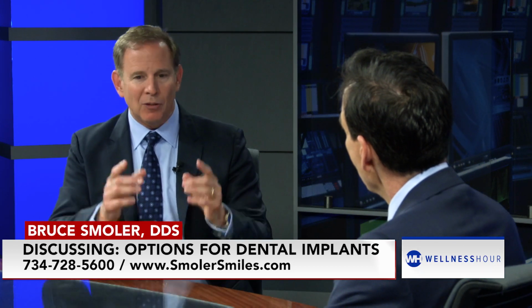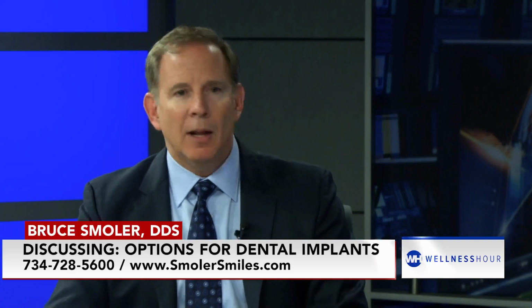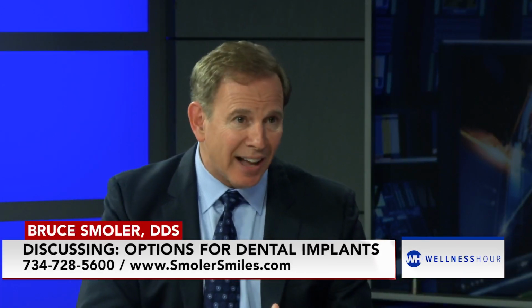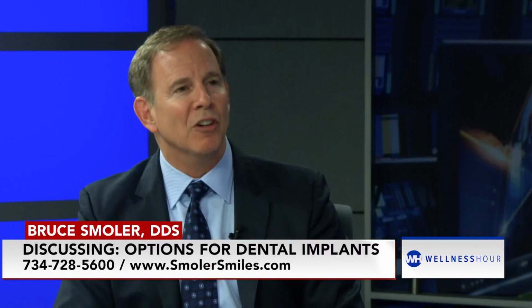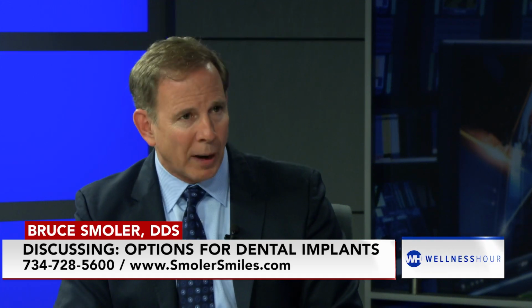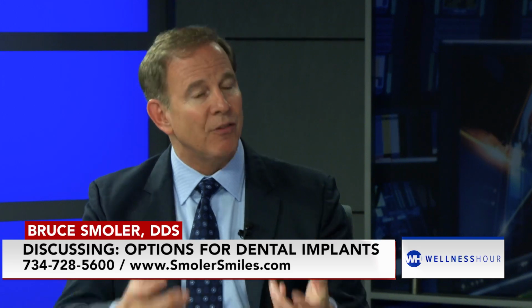Well, the problem is that that's like a pivot. The teeth rock back and forth. Like a snap-in denture? Yeah, snap-in denture on the bottom. I mean, it's better than nothing, I guess. But they're doing a lot of that where you are? Yeah, and it's sad because patients are frustrated. They're frustrated that it doesn't fit as well as they expected. It's still moving because by design, it's not fixed in place.